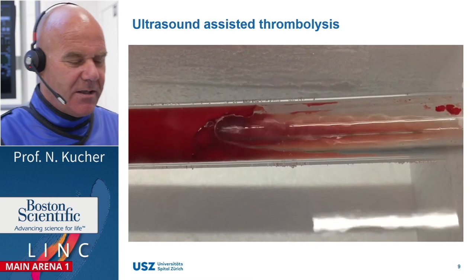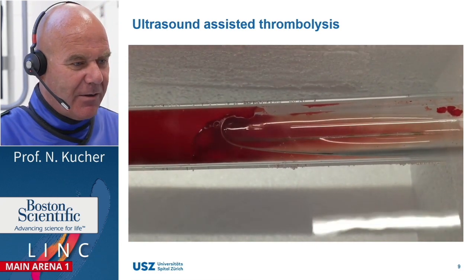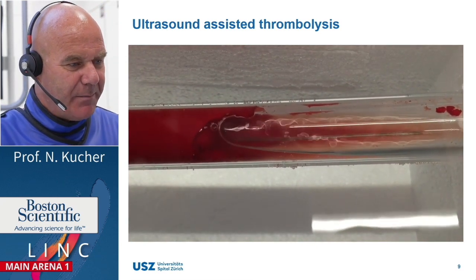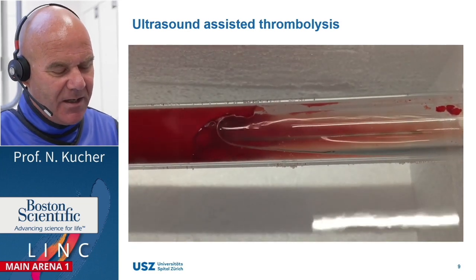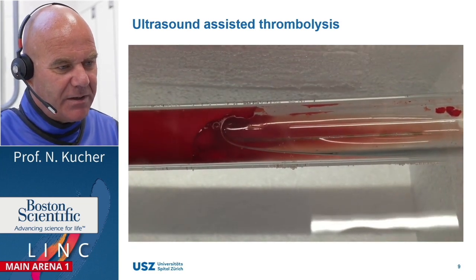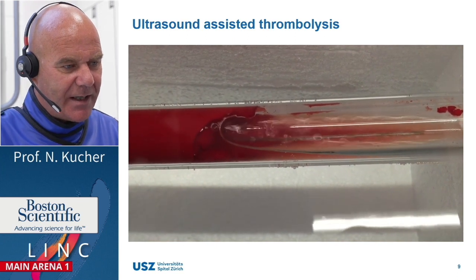So this is just the EKOS device in an in vitro experiment with human thrombi. You can see the bursts of the ultrasound energy being delivered over the device. Next slide.